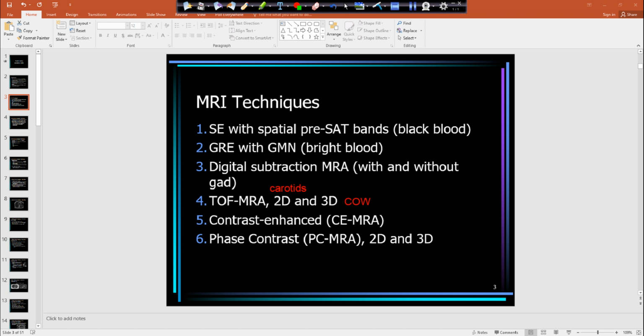We start our pulse sequence because we want to see if the tumor within the liver takes up that contrast in the arterial phase, or if it takes up that contrast in the venous phase, or if it starts to filter out in the delayed phase. So the radiologist is able to diagnose what type of tumor depending on when that particular cancer takes up the contrast, or allows it to flow out of that particular area.